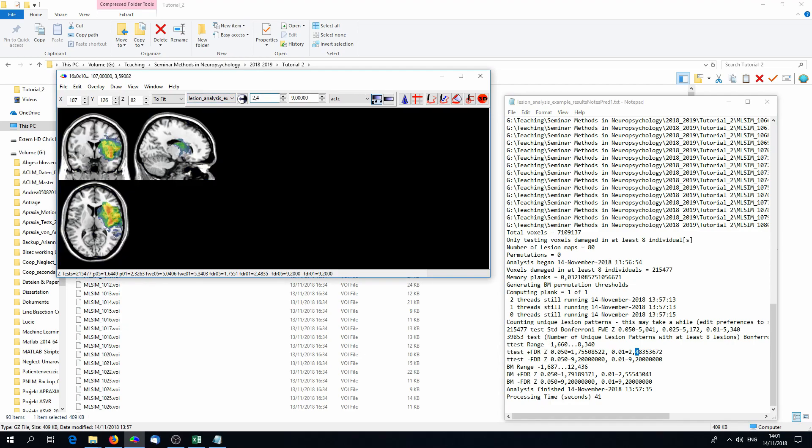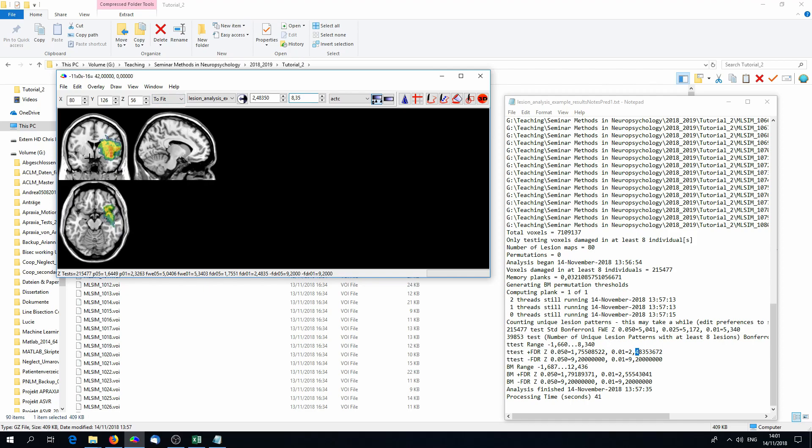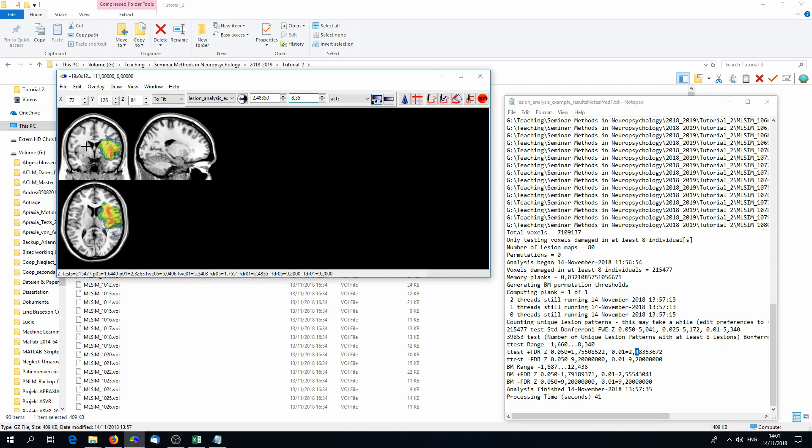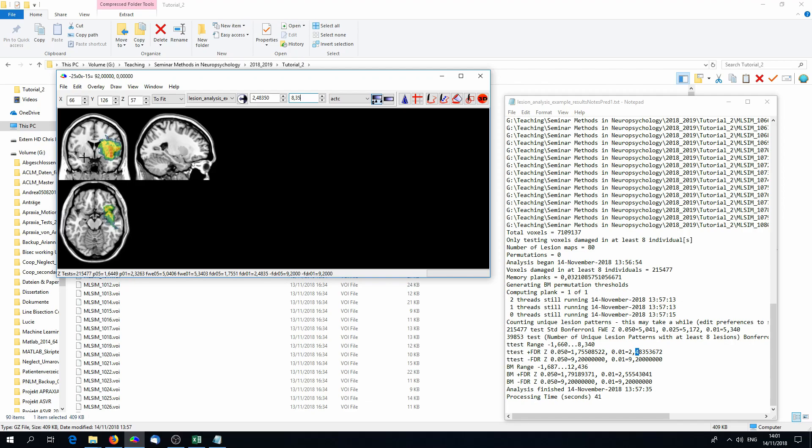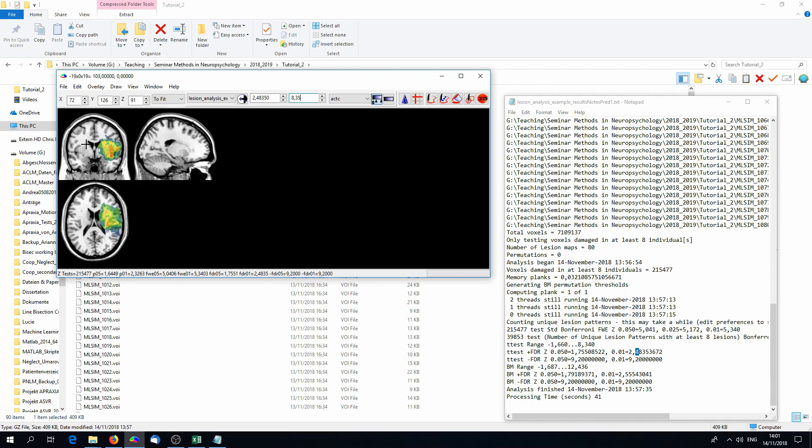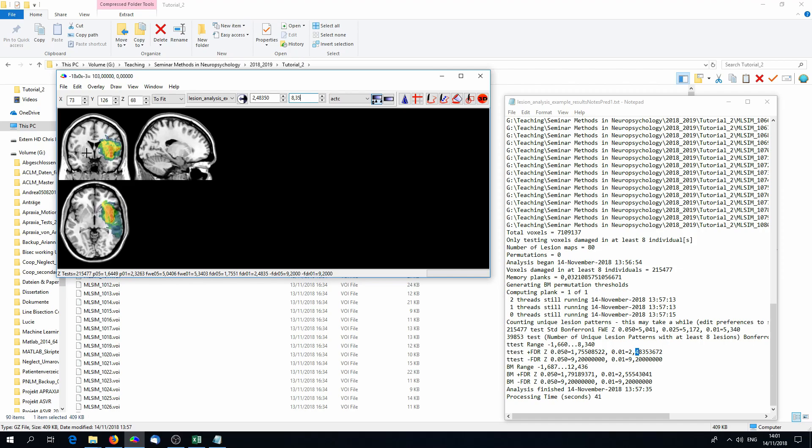So we put into MRI-cron 2.0 and so on and go to the maximum of 8.3. And so MRI-cron now depicts all voxels that are above the cutoff after FDR correction. So this also means that all voxels that are shown in color now are significant. That is the neural correlate of the behavior we investigated.